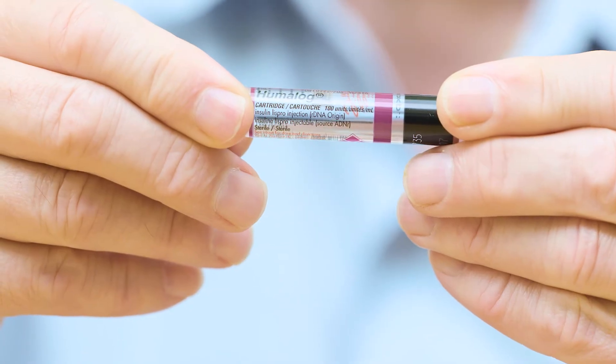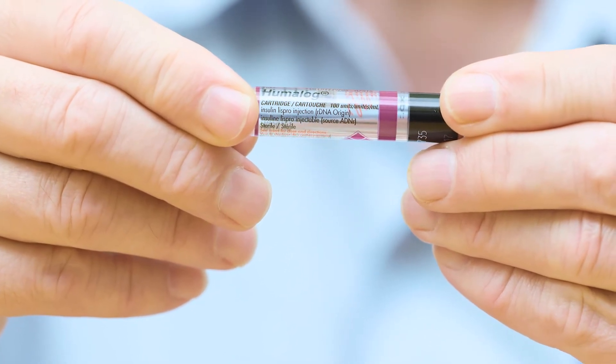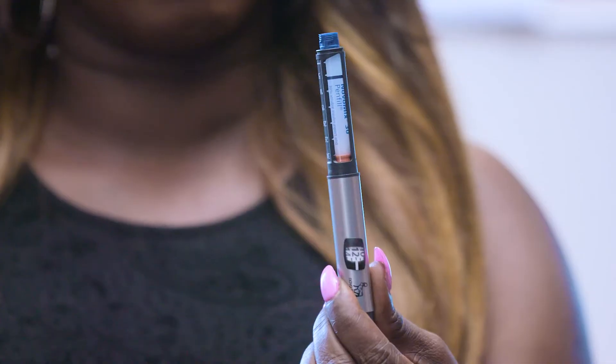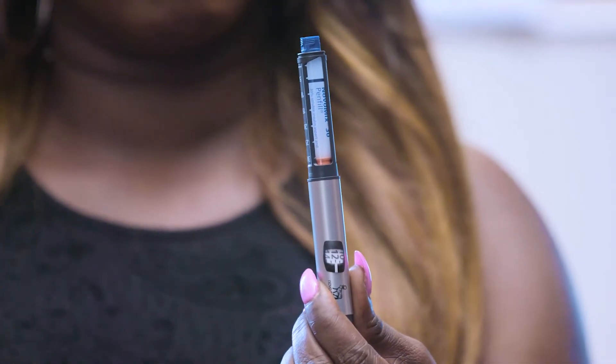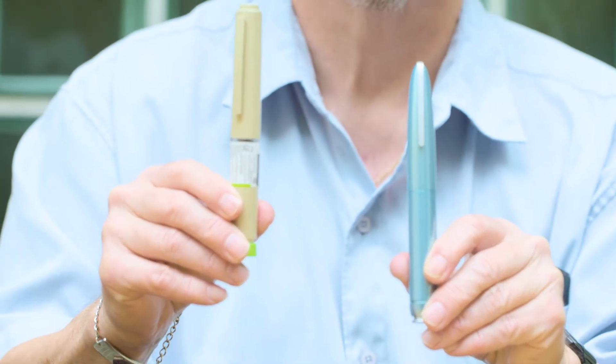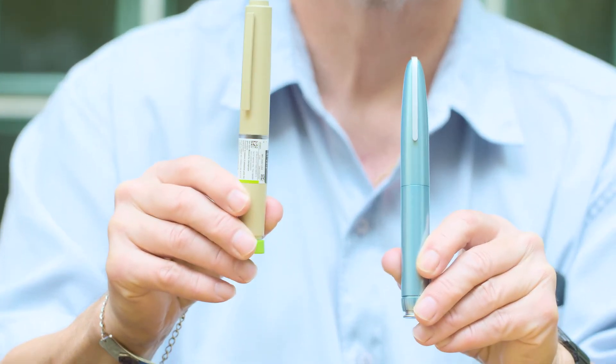Although they look different, one is no better than the other. If your insulin is supposed to be clear, make sure it's clear. If it's supposed to be cloudy, make sure it's not discolored. Check with someone on your diabetes team if you're not sure what yours is supposed to look like. If you are like Paul and have two types of insulin, make sure you have the right pen for your injection.